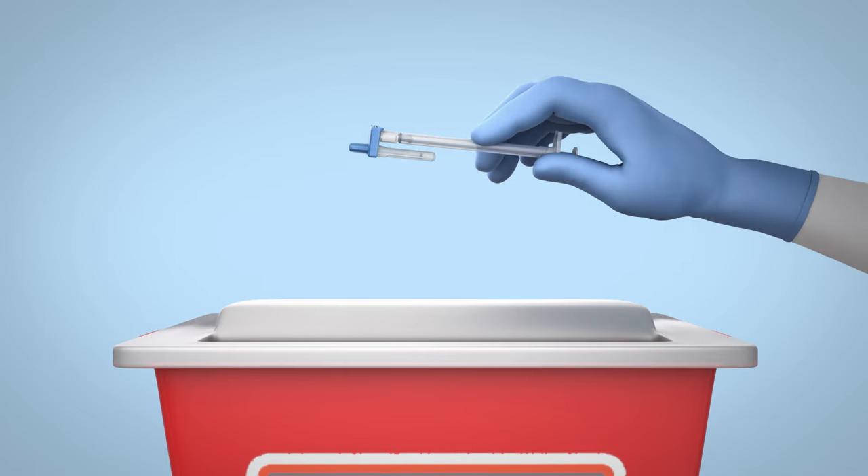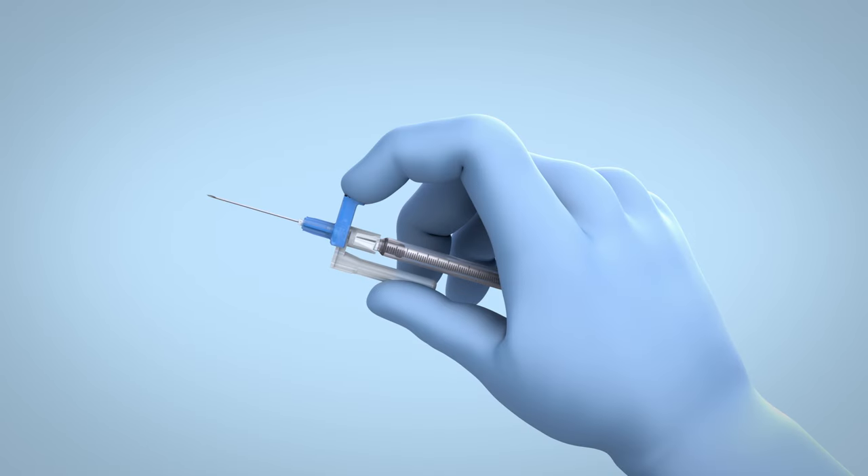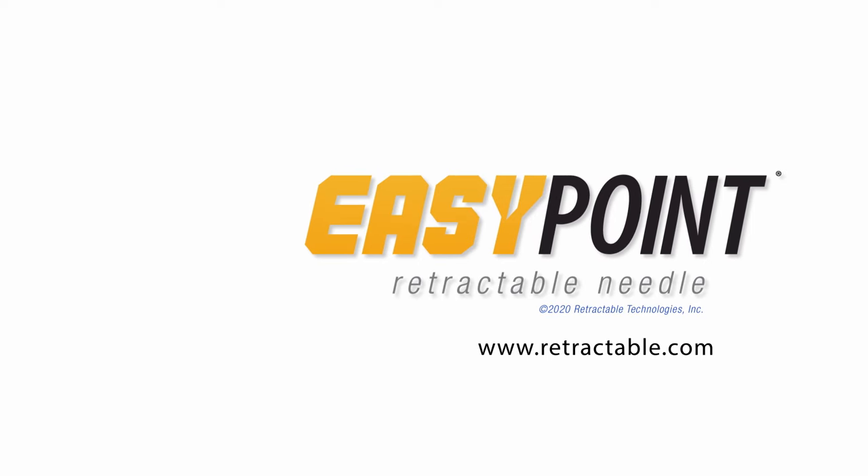Dispose of the used needle and syringe in an appropriate sharps container per protocol of your institution. EasyPoint — the safety of automated retraction technology with added versatility. For additional information, please visit our website at retractable.com.